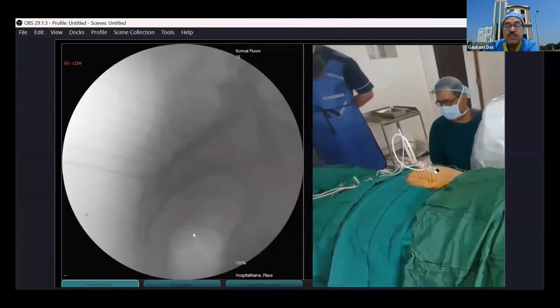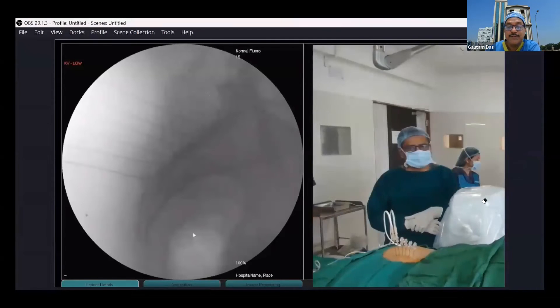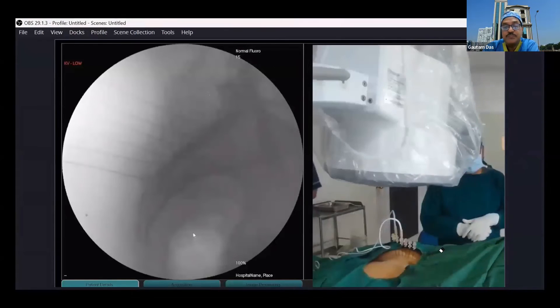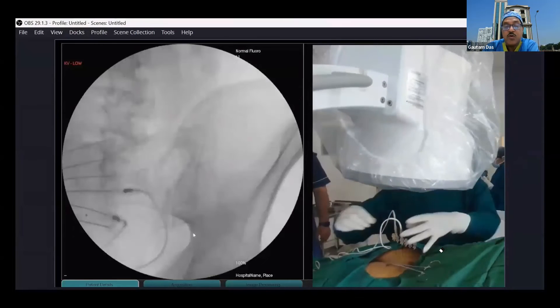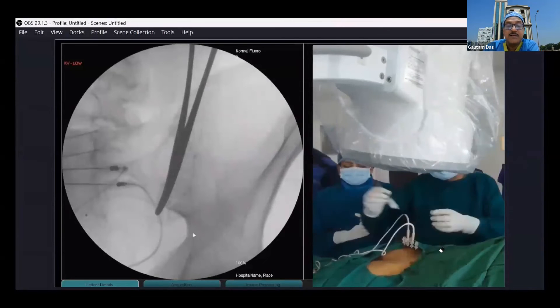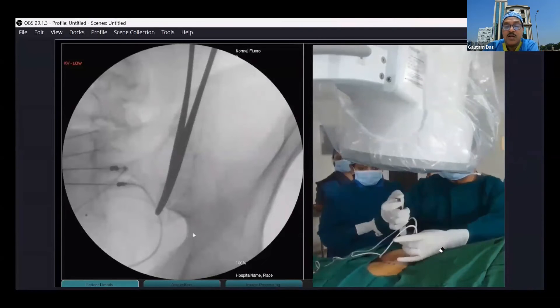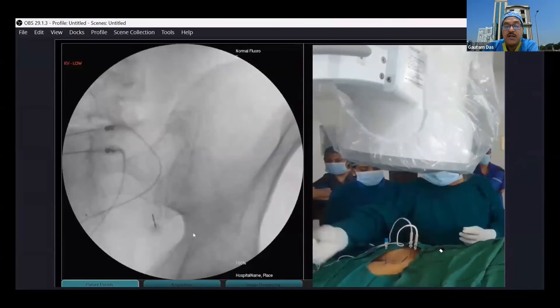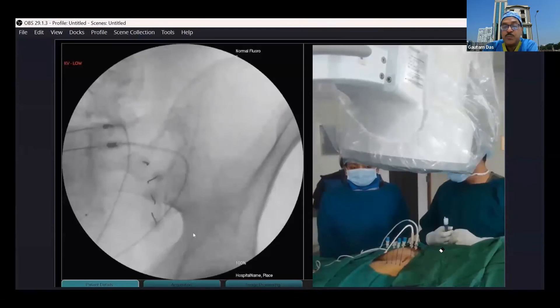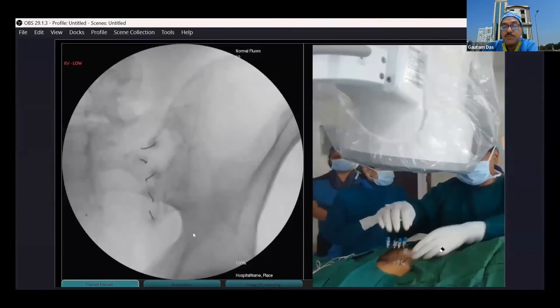First we did the left side, and then after completing that, we did the right side — almost similar procedures. Needle placement will use a contralateral oblique view to increase the visible space between the lateral sacral foramina and the iliac crest. We made the contralateral oblique view, and after completion of the procedures, we injected the steroid and removed the needles, then placed the needles on the right side in the same fashion, followed by steroid injections.